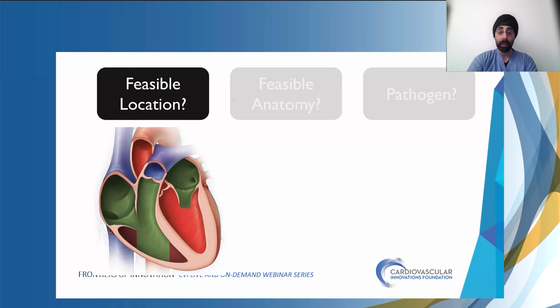I don't know if Paul, you have any thoughts on that. Yeah, Sanjam, I think it's a great point. I think if it's subvalvular, it basically warrants an IJ approach. It's pretty hard to reach transfemorally because of the curve and offset of the IVC.